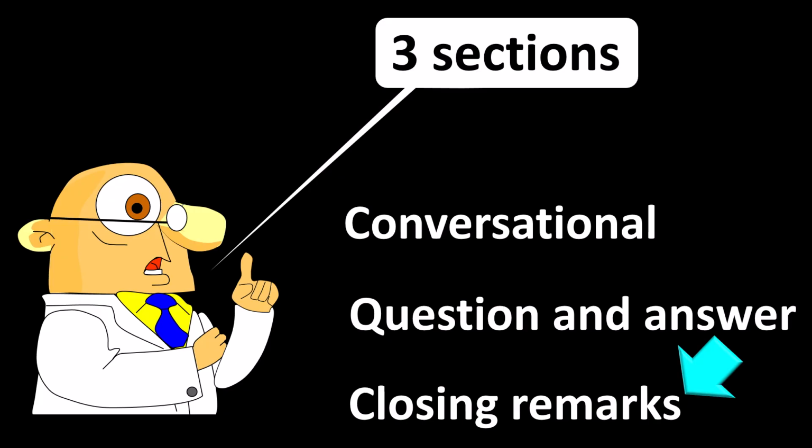So now I will start the second part of the third section, that is, the second part of the closing remarks. I will use the next few minutes to give you the roadmap I use to choose, from the different montages, the correct one for each occasion.